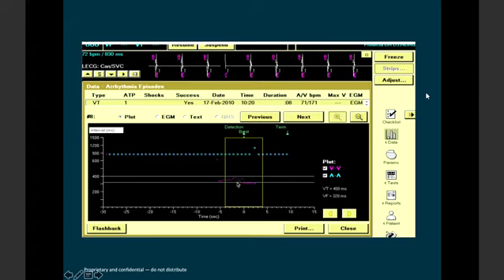It is not fast enough to come in the ventricular fibrillation zone. It is in the ventricular tachycardia zone. And what you see here is an anti-tachycardia pacing sequence: 8 pulses of anti-tachycardia pacing at a rate which is faster than the tachycardia rate. At the end of anti-tachycardia pacing, the ventricular tachycardia has been converted back to sinus rhythm, and the ventricular rate is now matching that of the atrial rate.